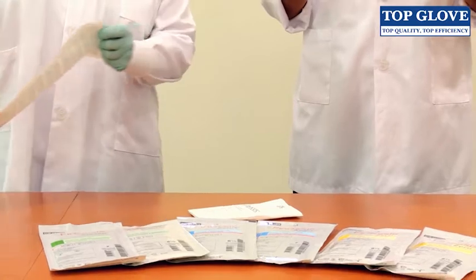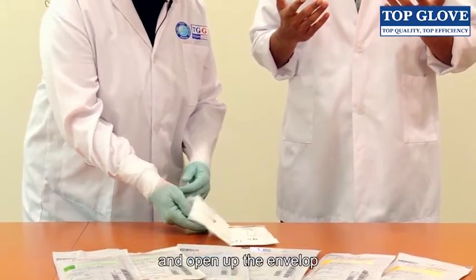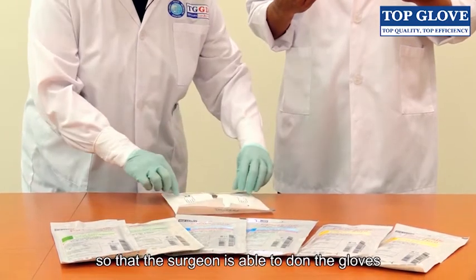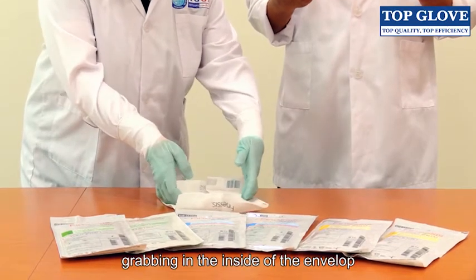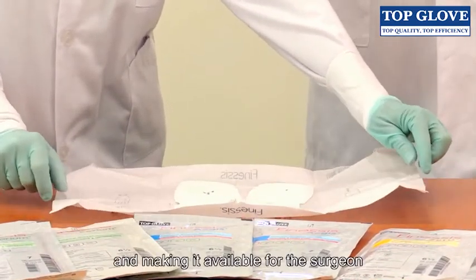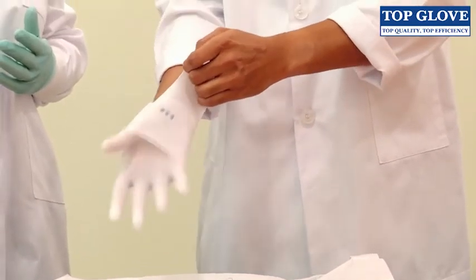Then you turn around with sterile gloves and open up the envelope, making certain to open the edges so that the surgeon is able to don the gloves. You grab the inside of the envelope and make it available for the surgeon.